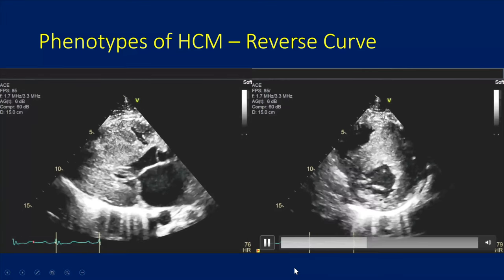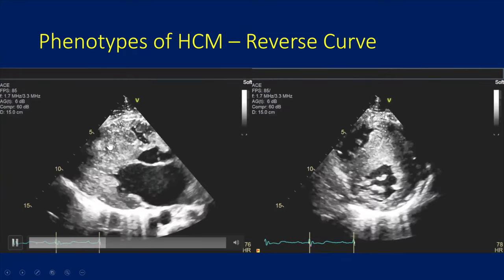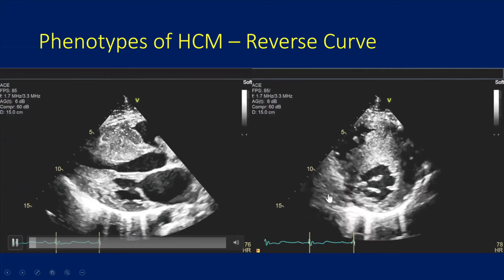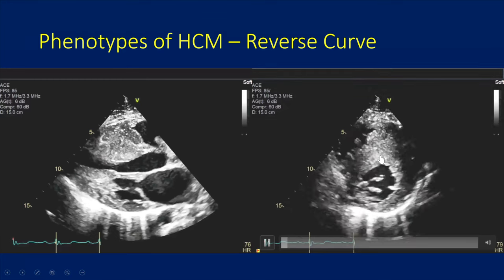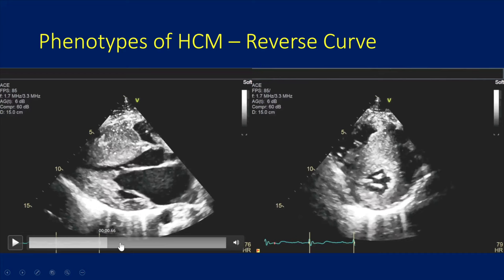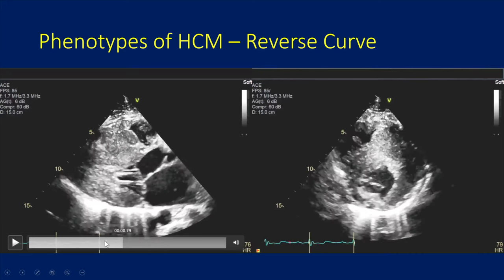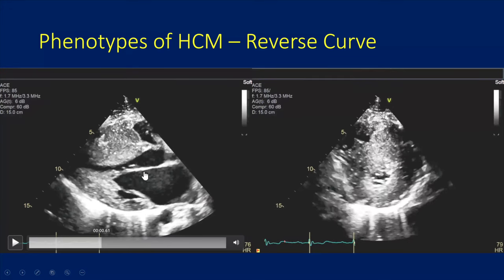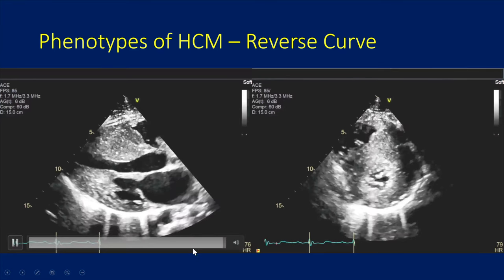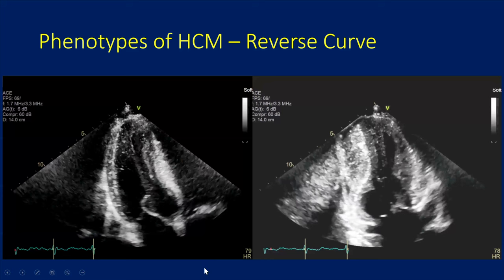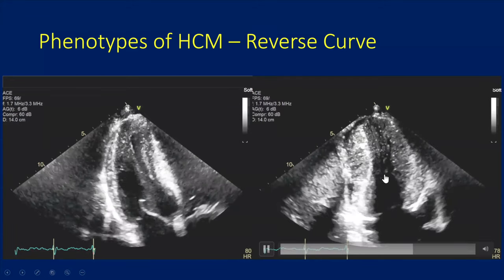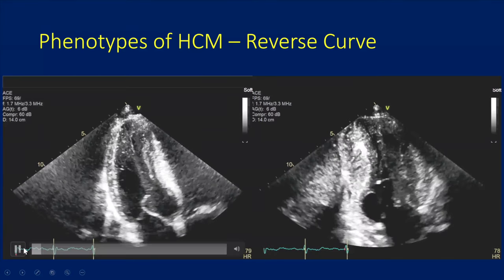This is the reverse curve HCM. As you can see, there's marked thickening of the mid-ventricular septum. The LV cavity is significantly distorted giving you more of a convex shape. In the short axis, you can see the mid-ventricular septum is quite significantly thicker. When this happens, the LV thickens at the mid-ventricular septum, which causes the LVOT to narrow and causes significant mitral SAM. These apical images of the reverse curve demonstrate just how distorted that cavity is and how convex that shape is — this is the classic reverse curve HCM.